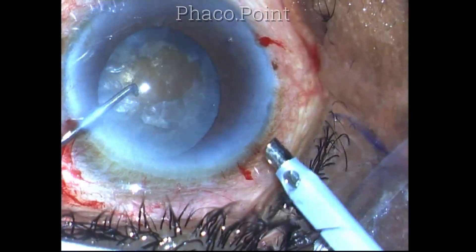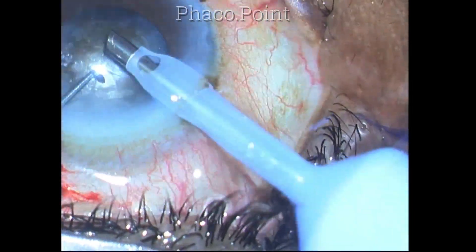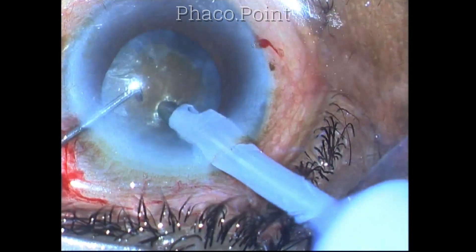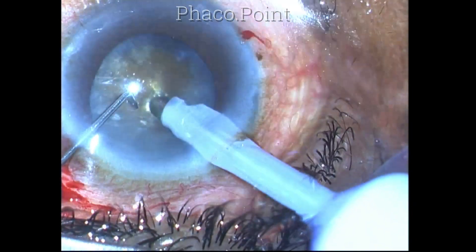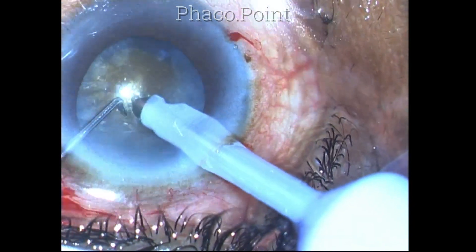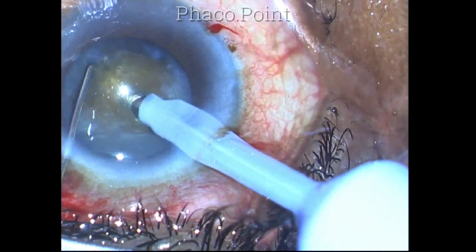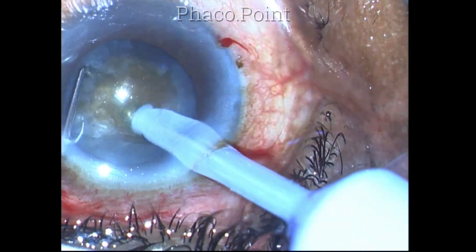Phaco emulsification is now being attempted with the direct chop method. I'm using the multi-burst mode of phaco emulsification with a power of 50%, a burst duration of 30 milliseconds, and a duty cycle of 80%.